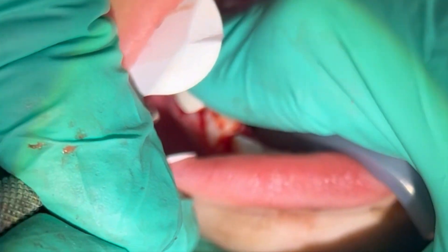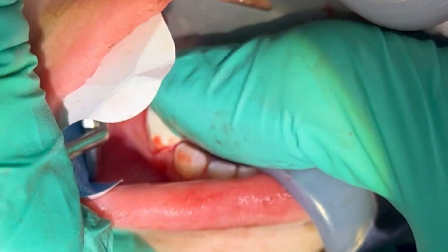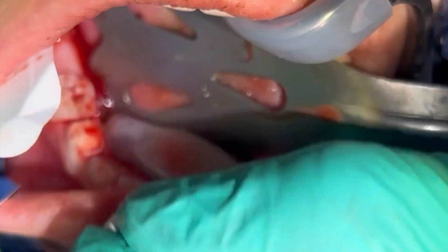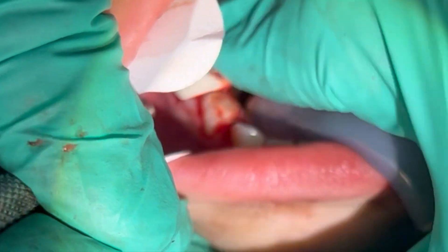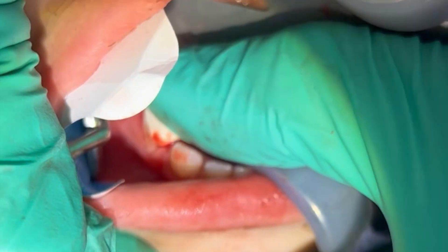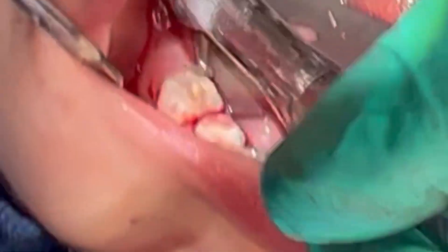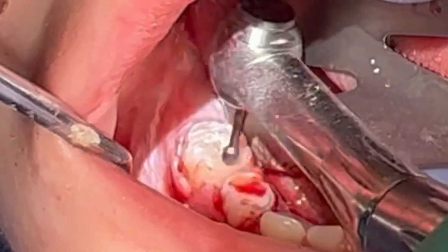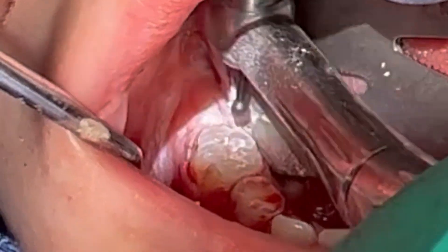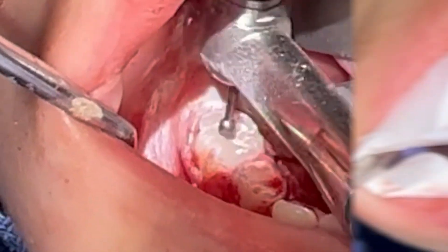When adapting a stainless steel crown preparation for a BioFlex crown preparation, additional occlusal reduction and circumferential reduction is noted. As you can see in the video, there is spring back and bouncing of the corresponding BioFlex crown sizes, not allowing for the snug active fit. Further occlusal reduction and minor circumferential preparation is required. With the additional occlusal reduction, there is a functional bevel that is rounded and placed on the buccal and lingual cusp, and all sharp point and line angles are rounded and smoothed.